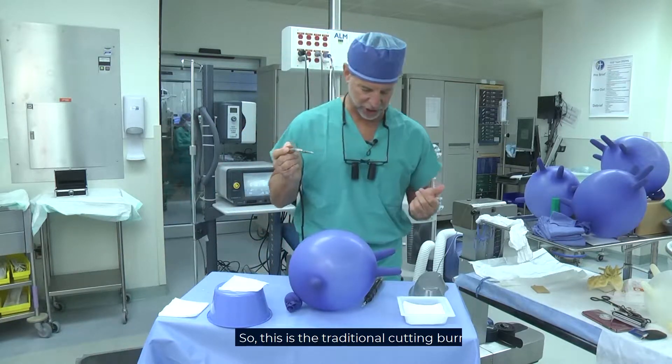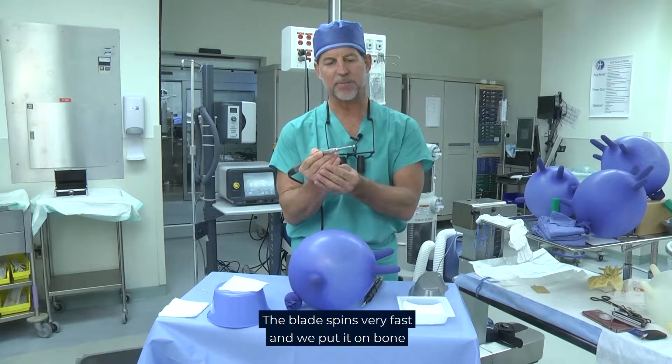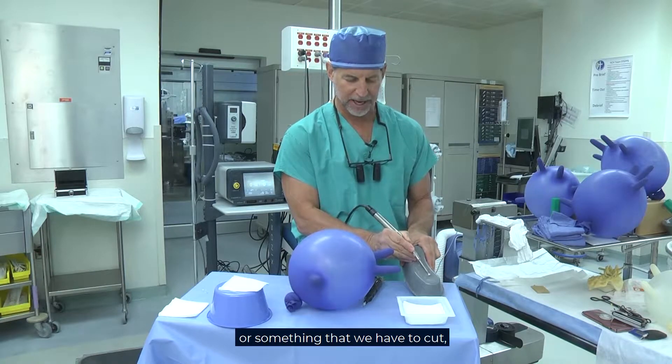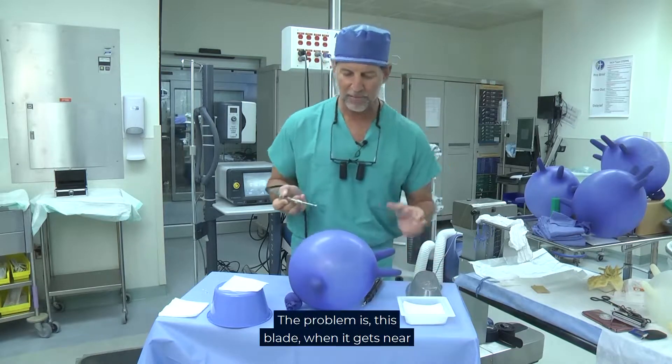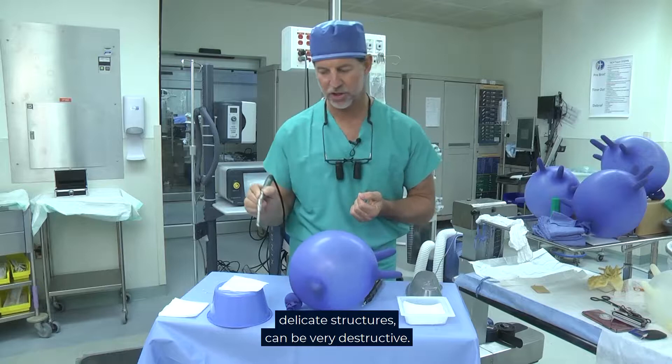This is the traditional cutting bur. It has a sharp blade, the blade spins very fast, and when we put it on bone or something that we have to cut, it essentially tears through it. The problem is this blade, when it gets near delicate structures, can be very destructive.